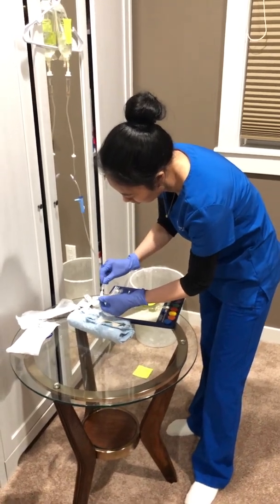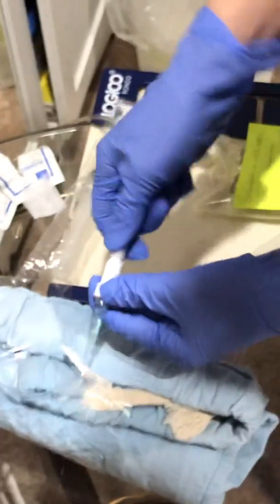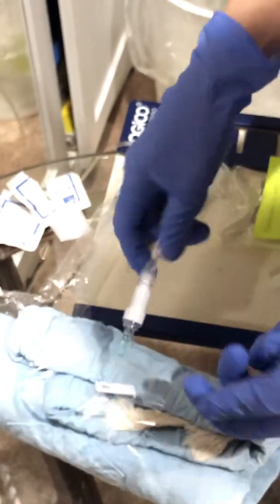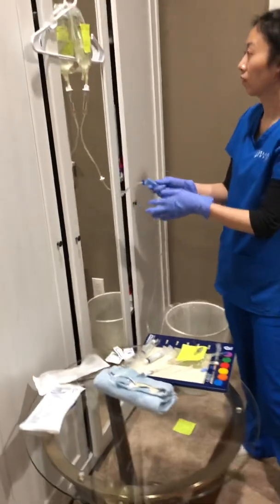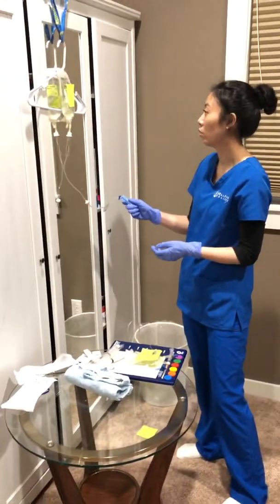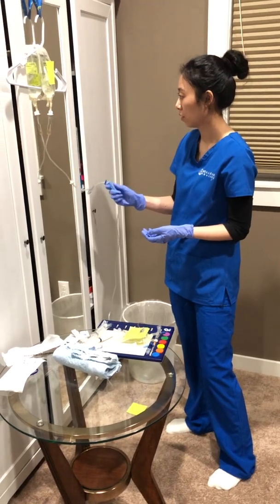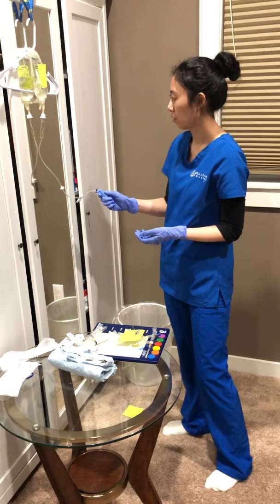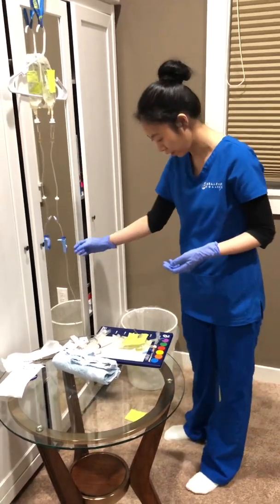Attached. Unclamp it. So set it to 21 drops per minute. Okay, so it's around 5 to 6 drops per 15 seconds, which is great.